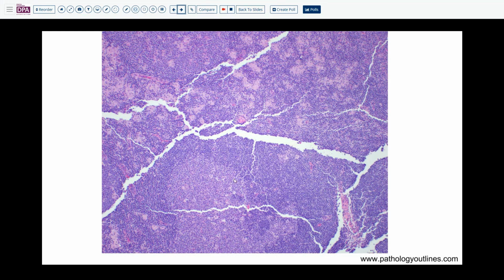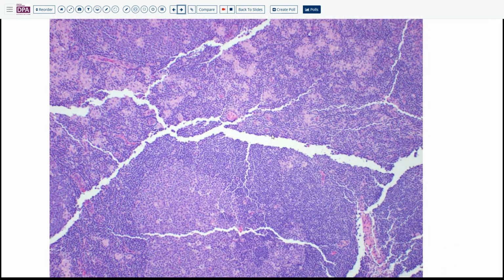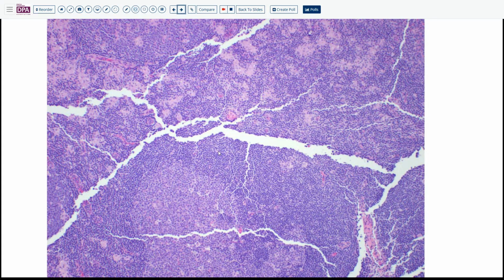Yeah, this is germinal center, epithelioid histiocytes, and then we have some pale cells. Surrounding the germinal center we have the mantle zone and marginal zone, and then going out, we do not usually see this kind of cell. This cell is called monocytoid B cell. Usually lymphocytes do not have this abundant cytoplasm like here, unlike mantle cells and marginal cells.